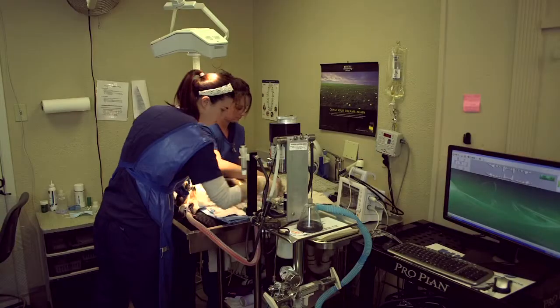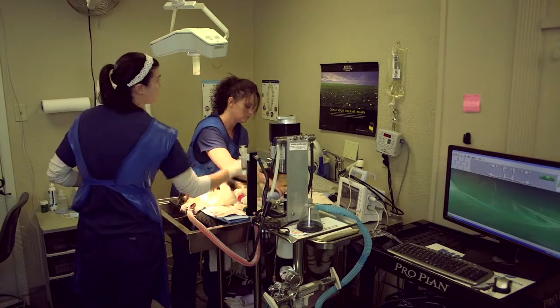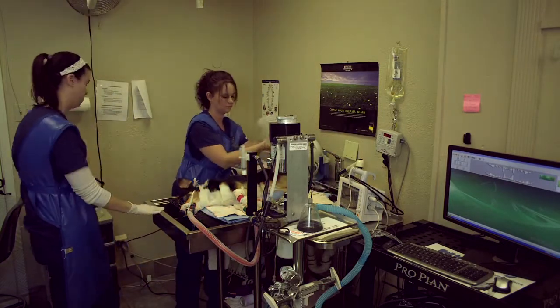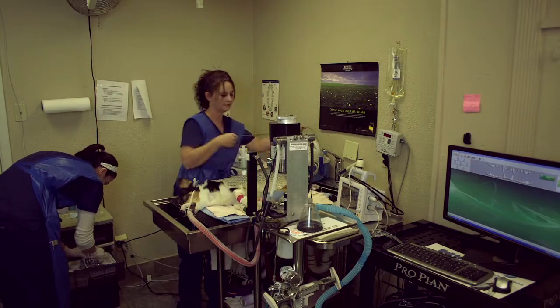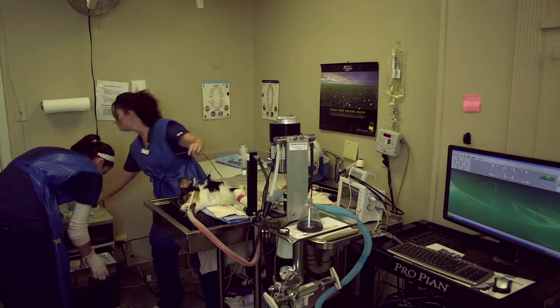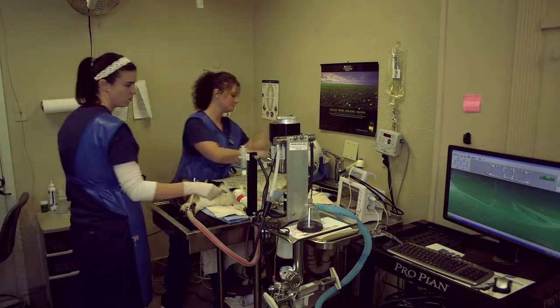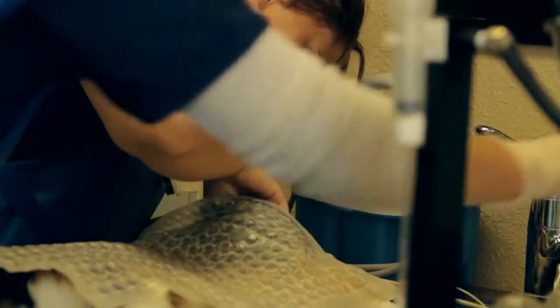You see that blue thing in Dallas's right hand? Dallas, would you pick up the egg? There you go. That is a fluid warmer that is warming the IV fluids entering SNAP's body. And this probe that Miss Dallas is hooking up now is a probe that will monitor SNAP's body temperature.